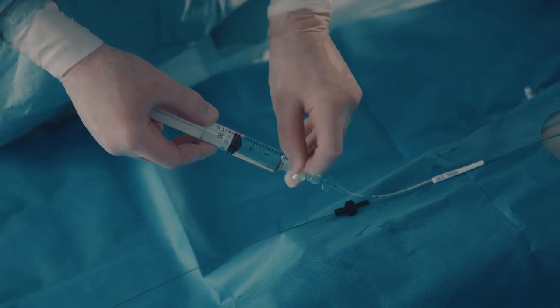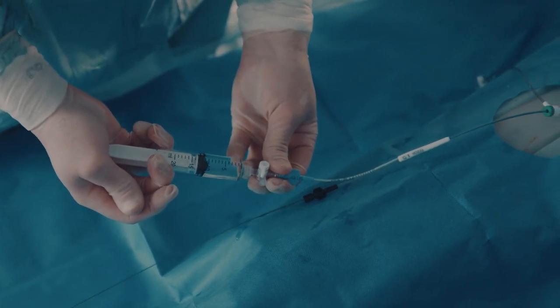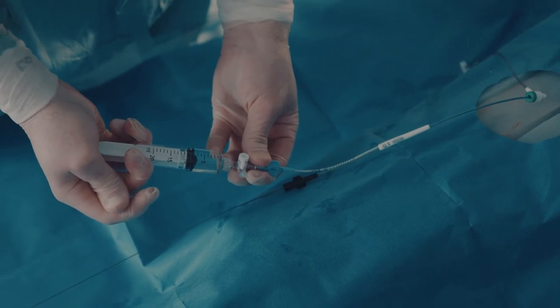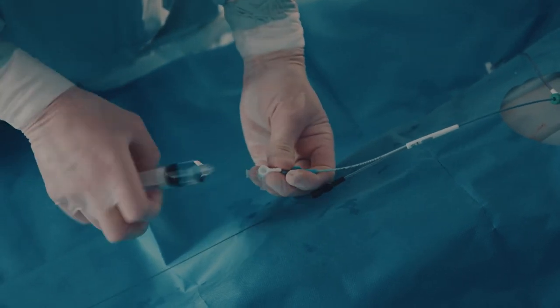Instill 8ml of saline or iodine contrast media in the 15x30mm balloon, and 15ml in a 20x30mm balloon. Iodine contrast is more viscous than saline and demands higher pressure to be instilled than saline. Close the stopcock when fully inflated.